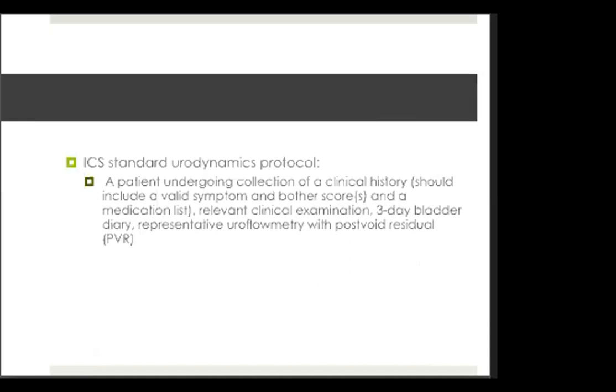So usually ang requirement before you do a pressure flowmetry, you do a bladder diary. Yes, sir. So pag meron kang bladder diary, makita mo na yung capacity niya. So pag nag-urodynamics ka, 'di ba nagbibigay tayo ng fluid, inflow. So yun yung ini-expect mo na yung time na yon na magkakaroon siya ng pakiramdam ng urgency or first sensation or the normal sensation to void. Yes, sir. Thank you, sir.